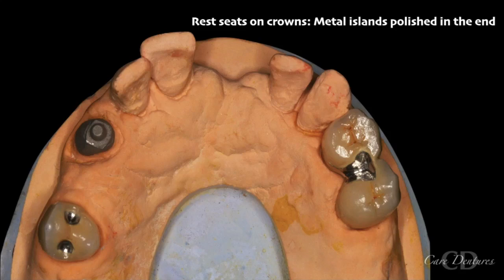In many instances, a surveyed cast crown or a bridge is a part of the whole treatment plan along with the cast partial denture. The rest seats in such cases need to be carved out on the crown, and the area in contact with the rest should be a polished metal island. No matter if it is a mesio or a disto-occlusal rest seat or an embrasure rest seat with a little more leeway for the interdental minor connector for that matter.